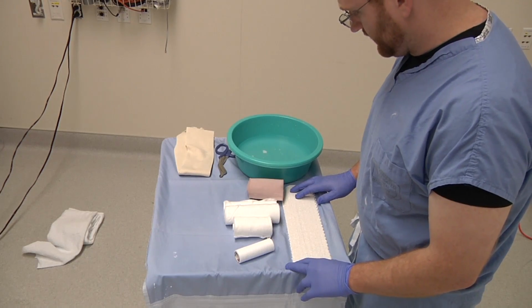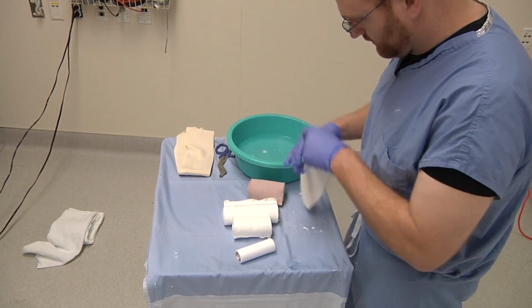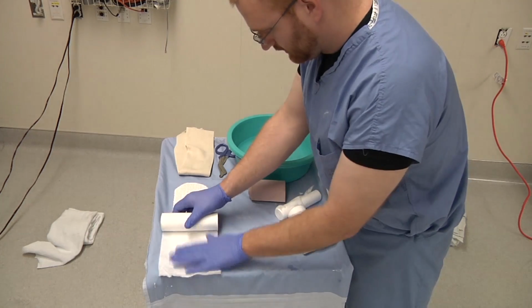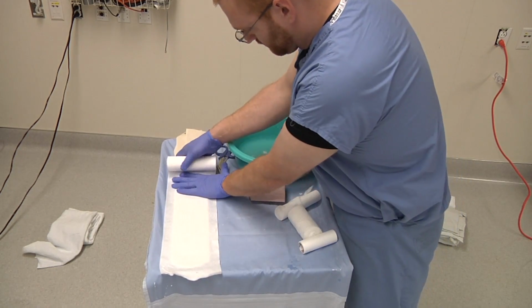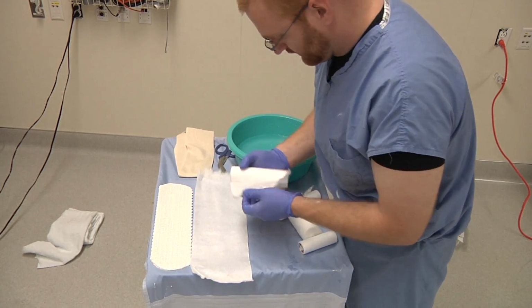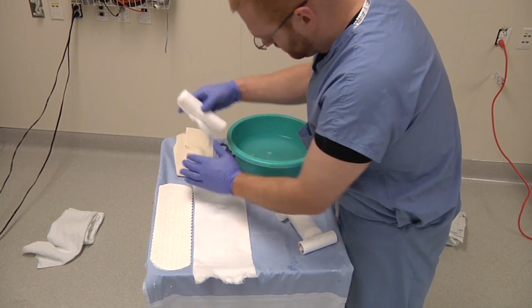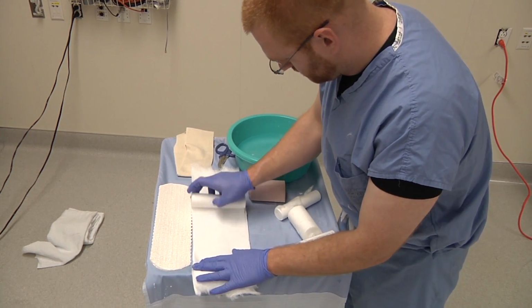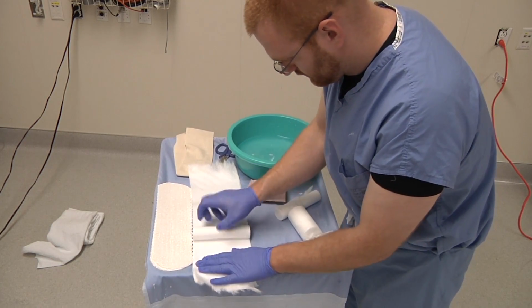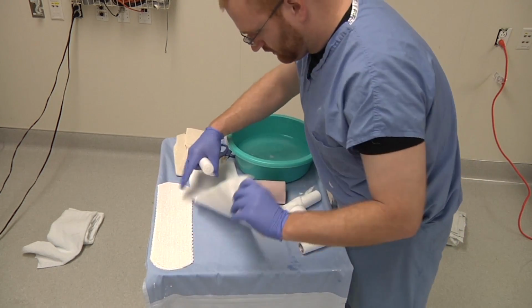Okay, this is how we make a simple volar resting splint. First off, we have our plaster. Make a simple burrito, measuring the length, usually maybe 2 inches on either side past that. And then we just make several plies, minimum of probably about 4. We will make 2 of these.